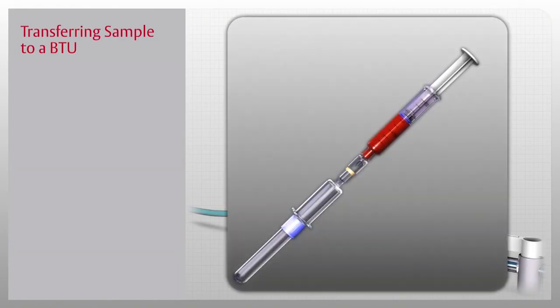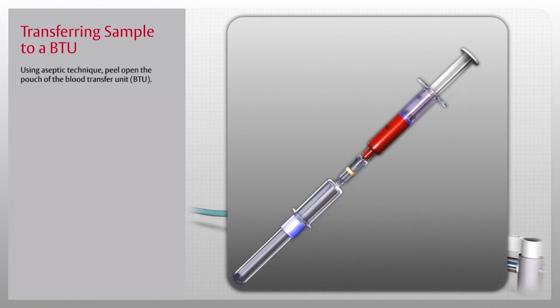To transfer the blood sample from the syringe to vacuum tubes, use the blood transfer unit, or BTU. Using aseptic technique, peel open the pouch.